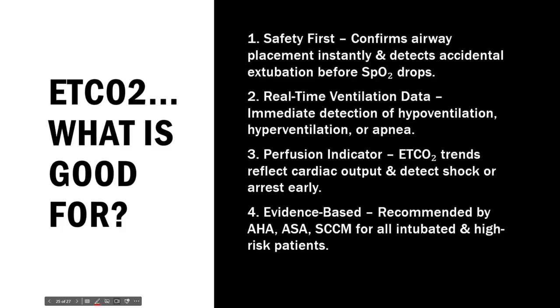All right, end-tidal CO2, what is it even good for? So, end-tidal CO2 is measuring the amount of expiratory CO2 in your lungs. So remember, going all the way back to biology, chemistry, as your body goes through the Krebs cycle to produce ATP, which is our body's form of energy, it has carbon dioxide as the byproduct of that cellular respiration.